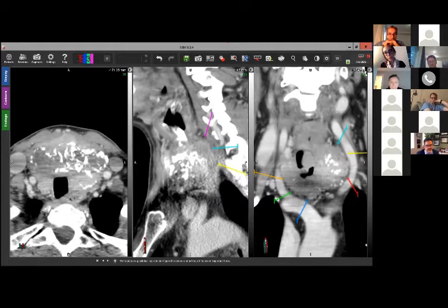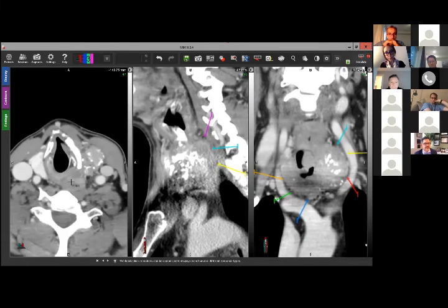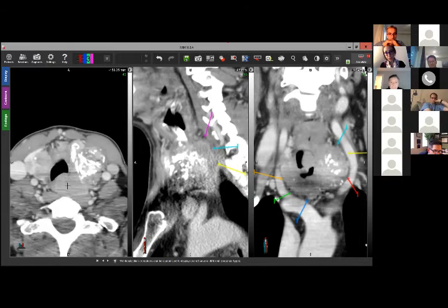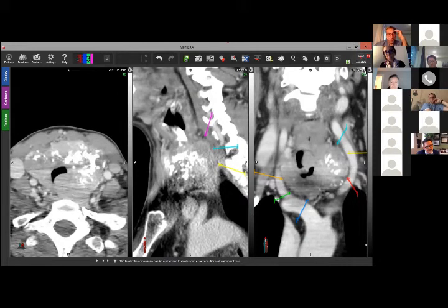Its relationship to the esophagus, when we go up, coming down from the hypopharynx, now it just became the esophagus here. It's completely inseparable from it, maybe infiltrating it. We can't really tell because we are losing the entire tissue plane here. And this picture is unfortunately highly concerning for prevertebral muscle infiltration because this fat, as you come down, is lost here, concerning for prevertebral muscle infiltration.